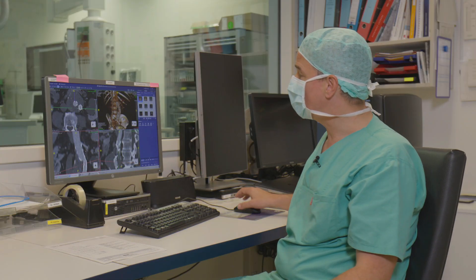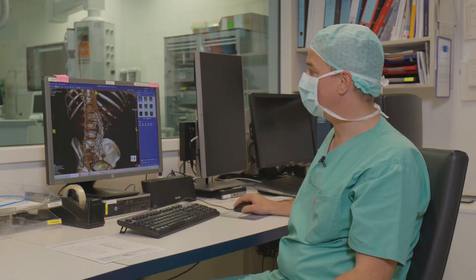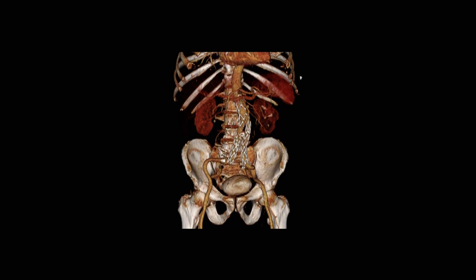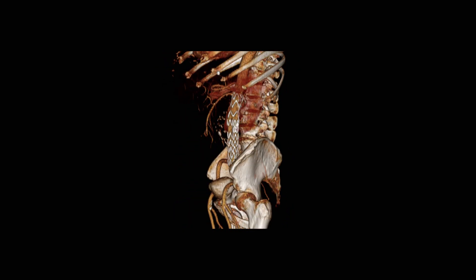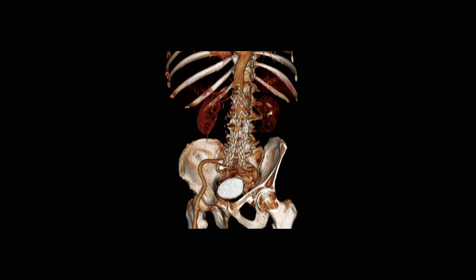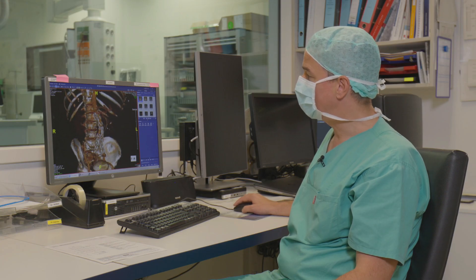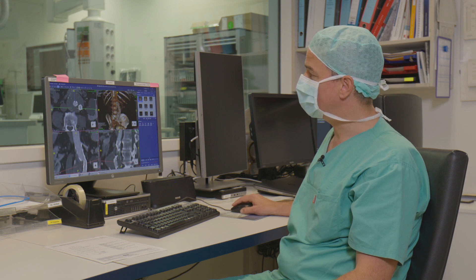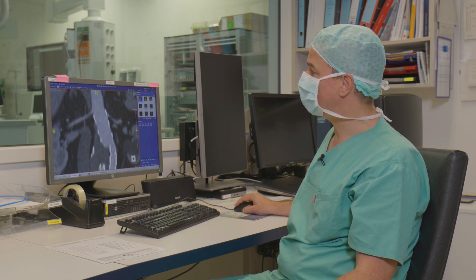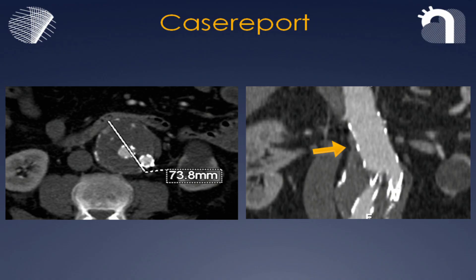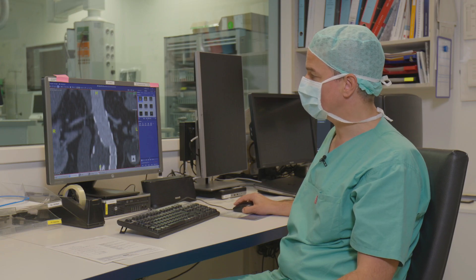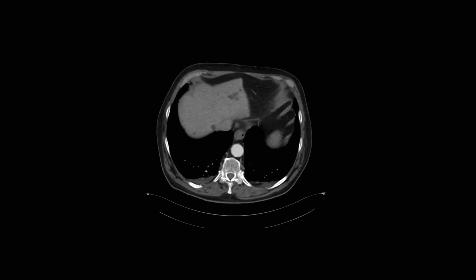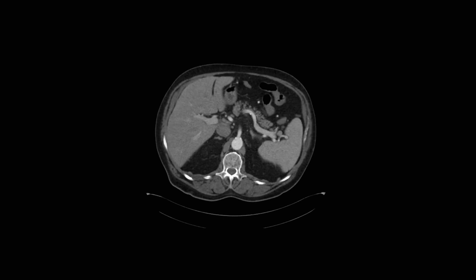If we want to take a look at the pre-op images, what you see here is that we have the old infrarenal device still in place. There is not significant migration, as you can see. It sits nicely. But what has happened is that the infrarenal seal has been lost. You see here that due to disease progression, the infrarenal neck has dilated.